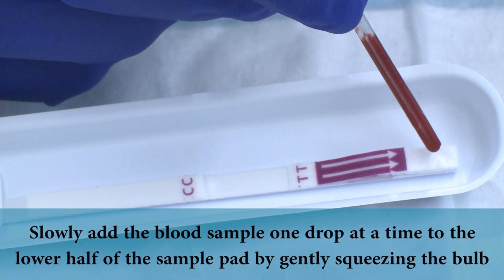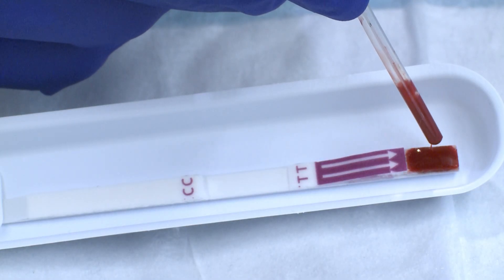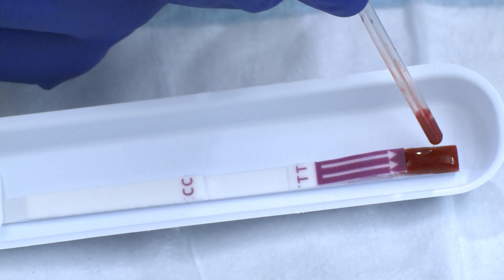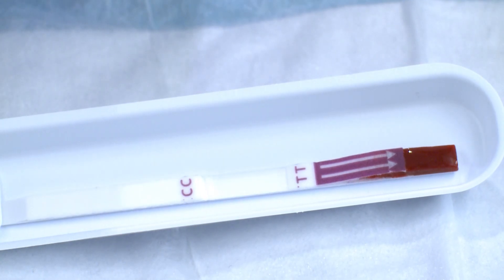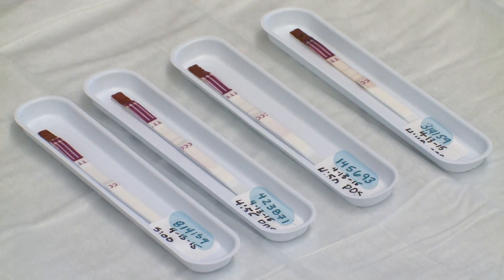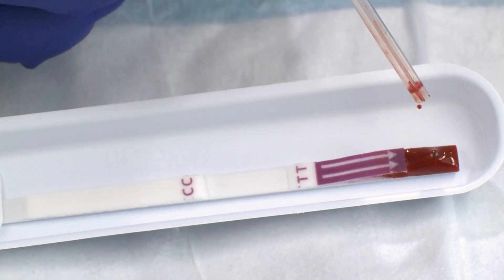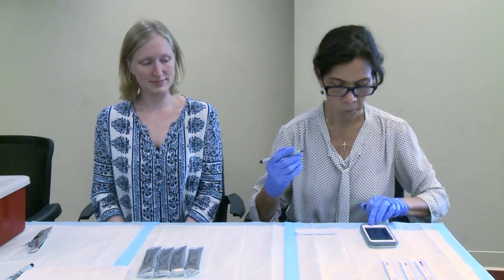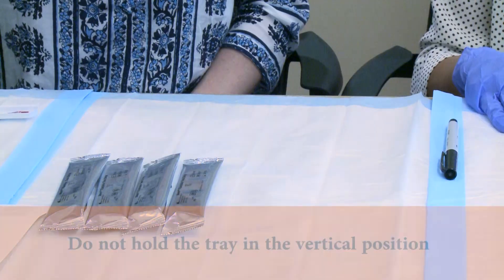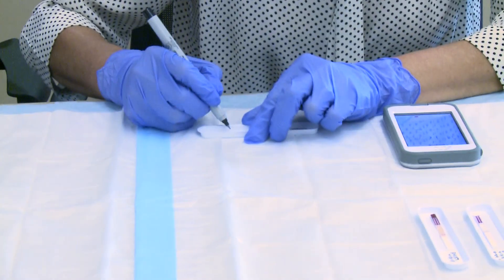Slowly add the blood sample to the lower half of the sample pad by gently squeezing the bulb. It is recommended to add the blood one drop at a time and allow the blood to saturate the sample pad before adding the next drop. The used micropipette should be placed in an appropriate waste container. Care should be taken to apply the blood to the labeled test strip corresponding to the person being tested. Do not add blood directly from the finger to the test strip. After the blood is applied to the sample pad, the plastic work tray holding the strip should be carefully passed to the team member responsible for timing and reading the test results. The tray should not be held in the vertical position. Do not disturb or move the test strip too much after the sample has been added.